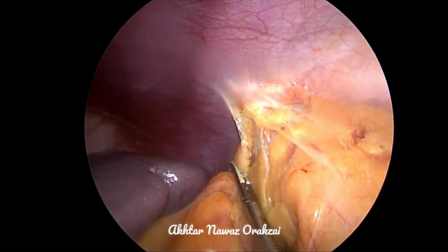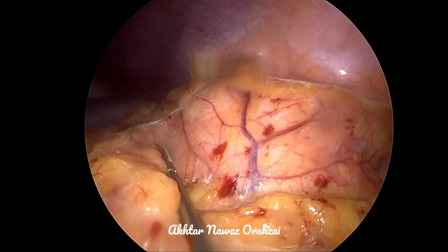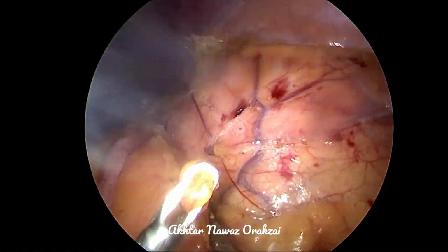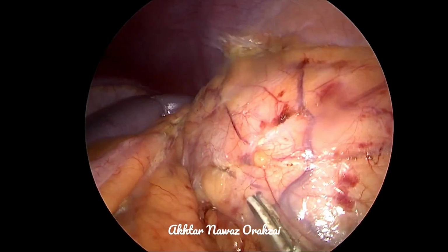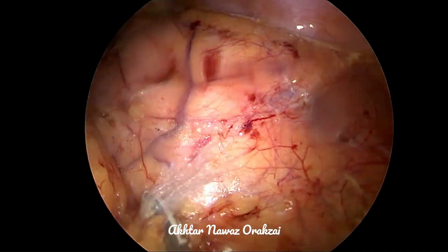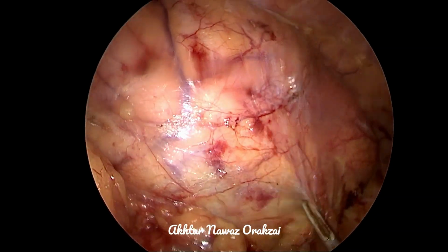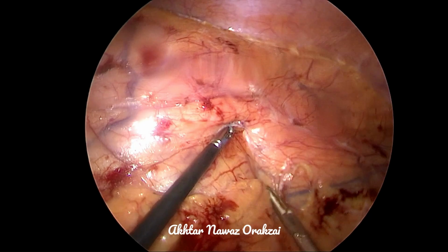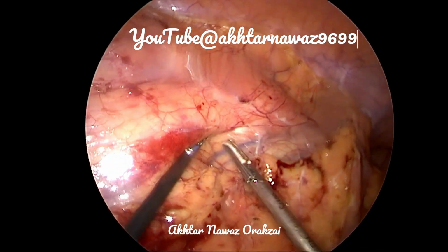As discussed previously in many videos, the left-sided procedure on the upper tract requires mobilization of the colon, and the extent of the mobilization is from the pelvic brim or the confluence of the common iliac artery, where the ureter usually crosses the artery, and up to the left crus of the diaphragm.